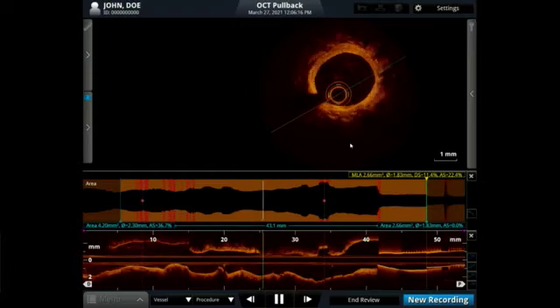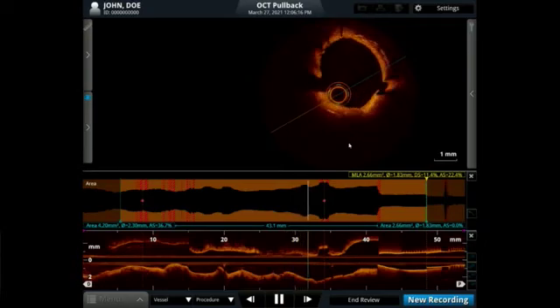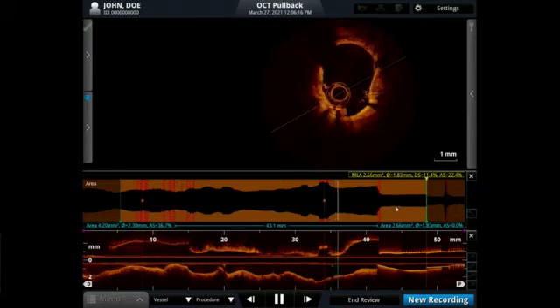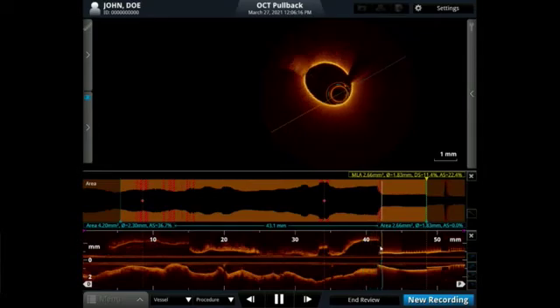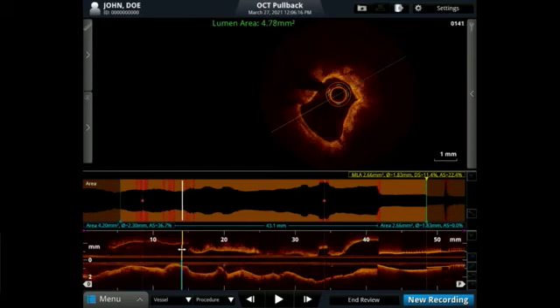So can you put the markers either side of the lesion, and then show us? We will. You see the difference, huh? Jonathan, can you do it? Do you agree? This is like perfect. Yeah, I'm a little surprised it's as good as this. I mean, really, that's very impressive. Dilating first with the balloon and then moving forward. Yeah, this is it.